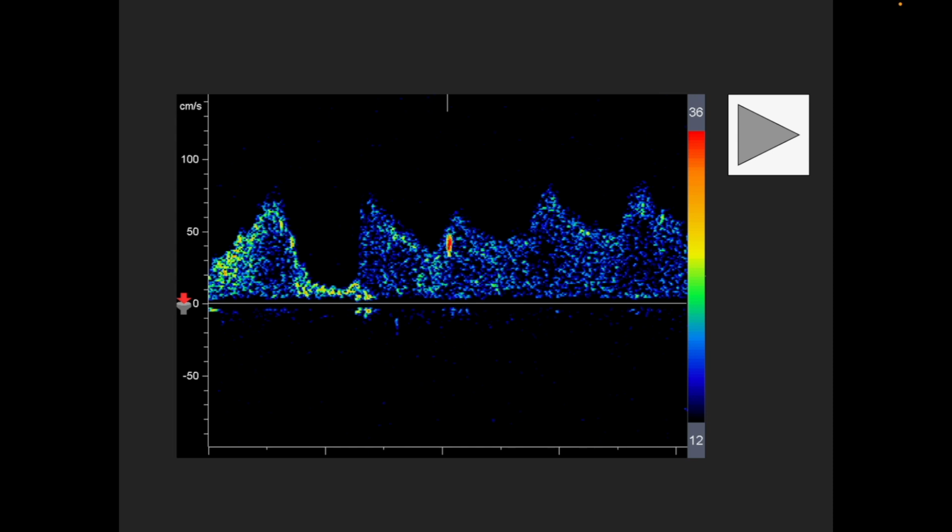If we take the velocity of the microembolic signal into account and the distance between the middle cerebral artery, where we pick up the microembolic signal, and the internal carotid artery, where the surgeon had pulled the vessel, it is obvious that pulling the vessel and hence irritating the plaque inside caused the release of this microembolus.